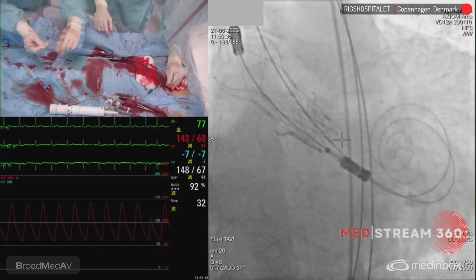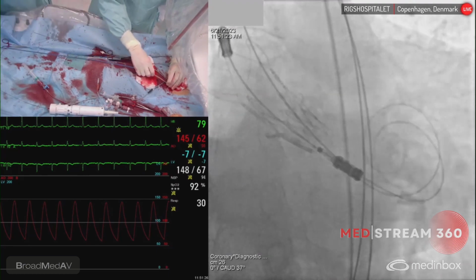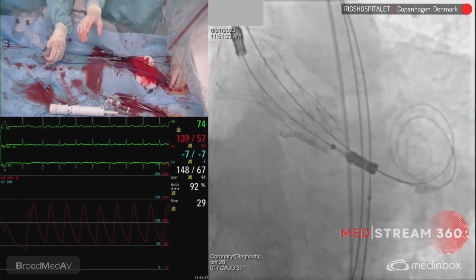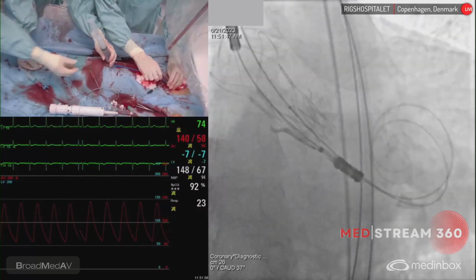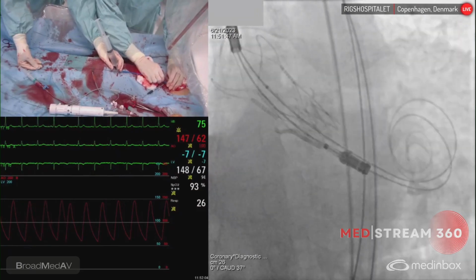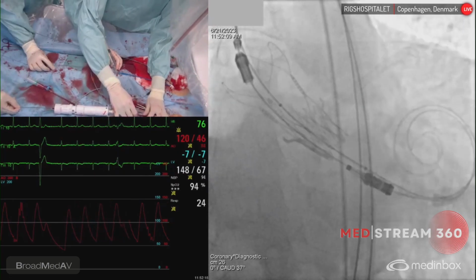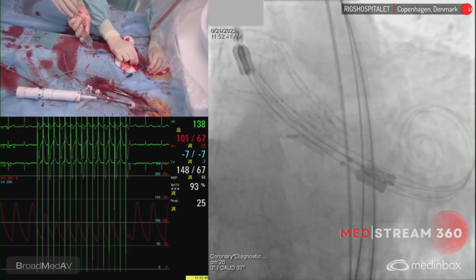Balloon is ready, please. We need very, very good pacing. Absolutely. Yeah. Somebody hold the wire, please. Hold the wire, please, Alejandro. I'm going to position it officially good, to the mid of the valve. Like there. Yeah, all right. Now I'm going to push this a bit deeper. Can somebody hold this here? I'm going to push this so it's as much as possible out of my way without perforating the LV. Yeah, okay. I think it's fine. So we only go up with the balloon if the pressure is down. Not full capture.